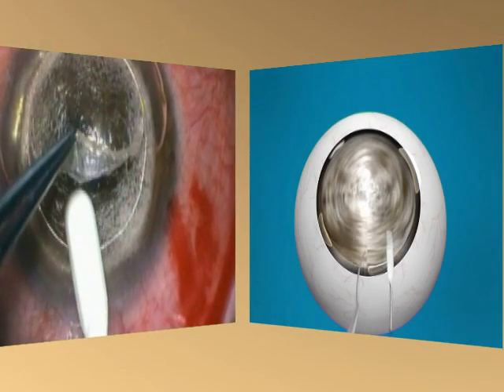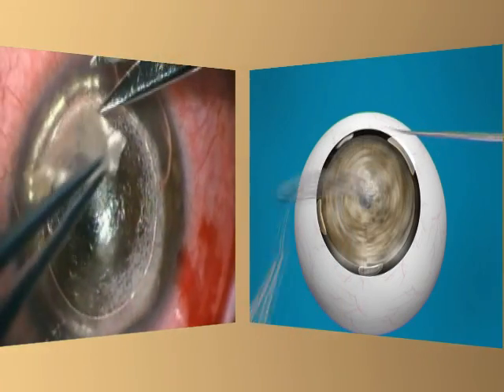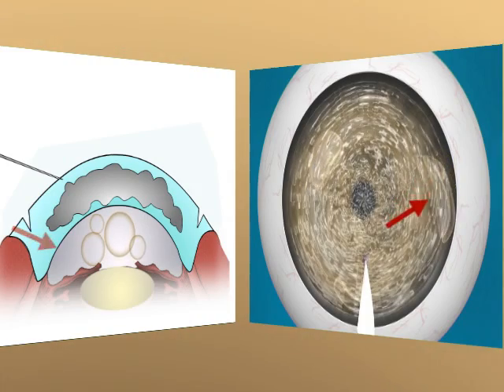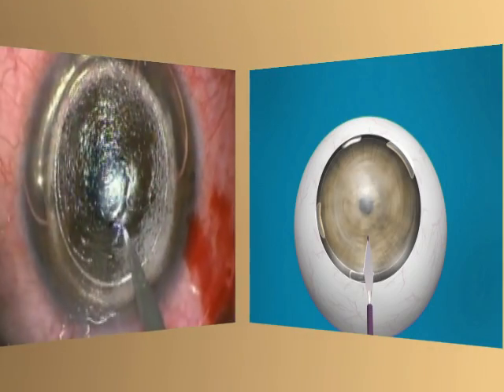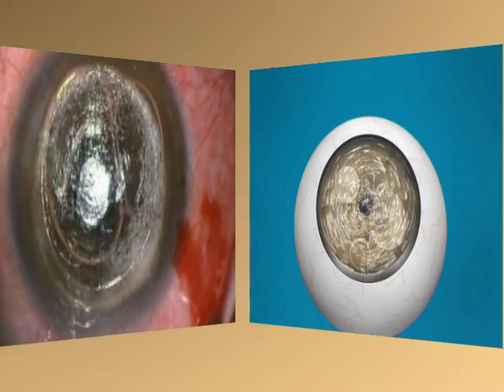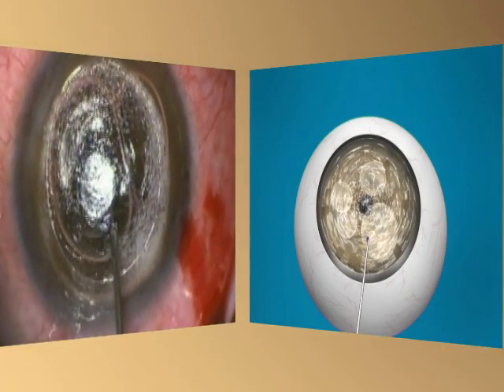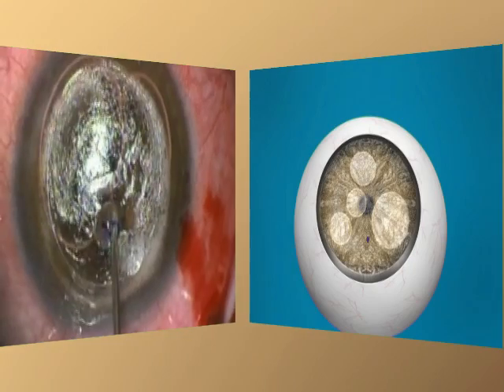Debulking of the anterior two-thirds of the corneal stroma was then done, leaving a thin layer of posterior corneal stroma underneath. A 15-degree blade stained with gentian violet was used to create a shelved opening into the potential space between the Descemet's membrane and the posterior stroma. Entry into this space was easily identified by the dynamic movement of the small bubble from the periphery of the anterior chamber back to the center of the AC. At this point, the incision was immediately discontinued and 2% hydroxypropylmethylcellulose was injected through the opening into the potential space to clearly delineate it.